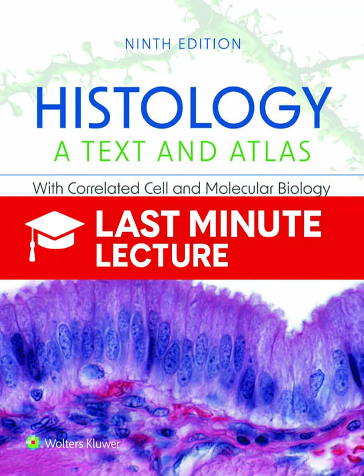All right, we've moved from general chemistry to enzyme activity. And now we get to the ultimate level of molecular recognition, immunocytochemistry. This is all about the precise lock-and-key binding of an antibody to its specific target, the antigen. This was the specificity revolution in histology. Antibodies are these large glycoproteins, immunoglobulins, that our immune system makes. We can purify them and chemically link or conjugate them to a detectable marker. Usually a fluorescent dye, a fluorochrome.